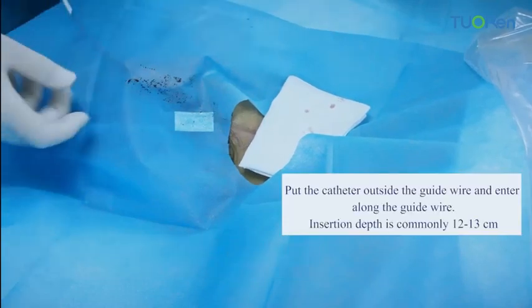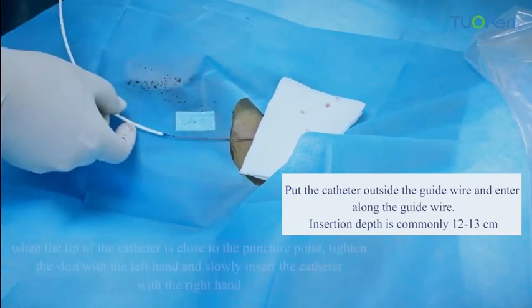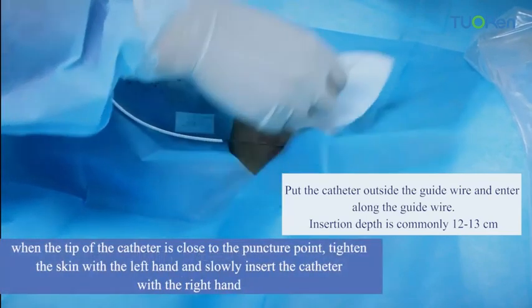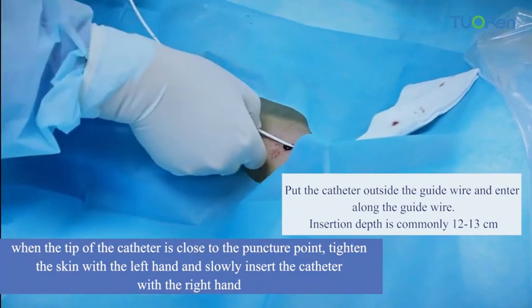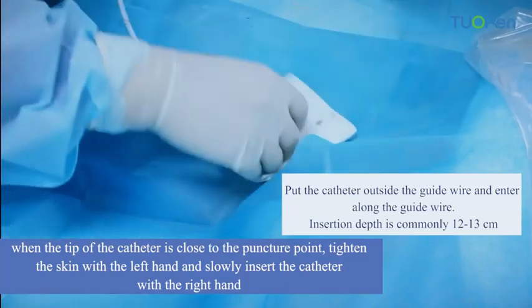Put the catheter over the guide wire and enter along the guide wire when the tip of the catheter is close to the puncture point. Tighten the skin with the left hand and slowly insert the catheter with the right hand.